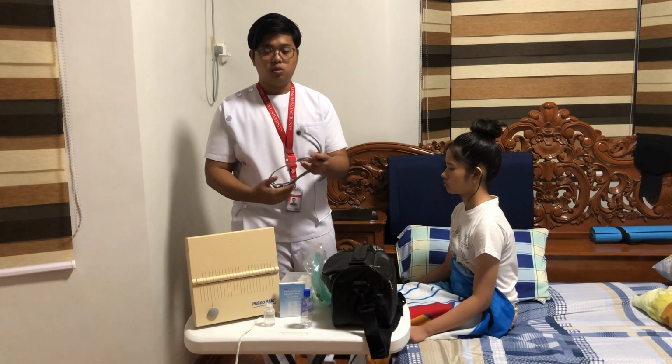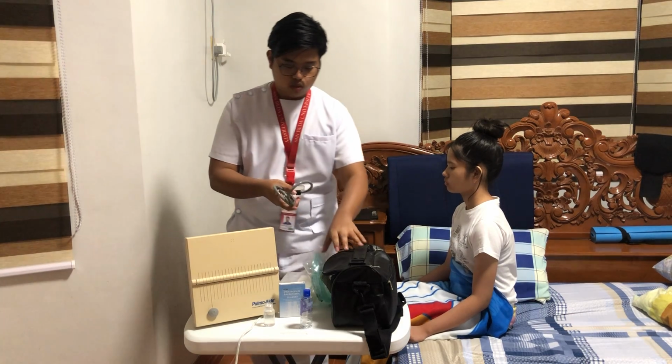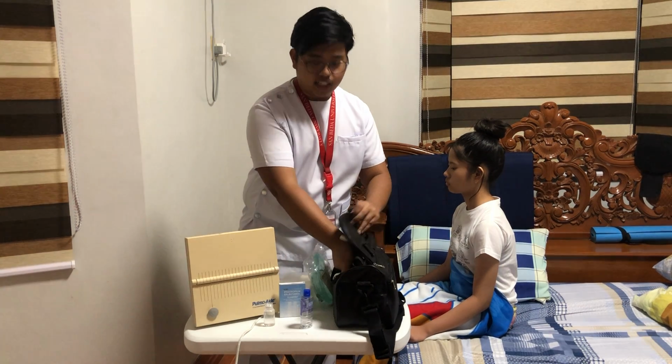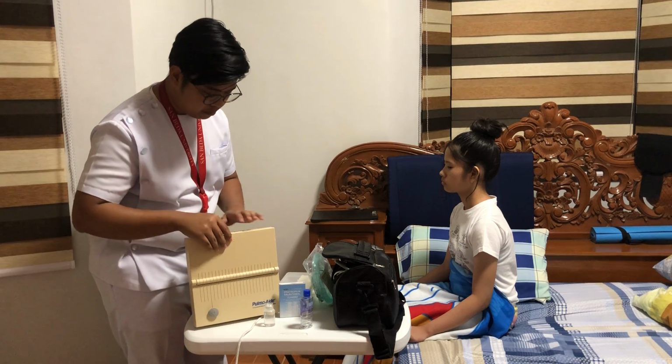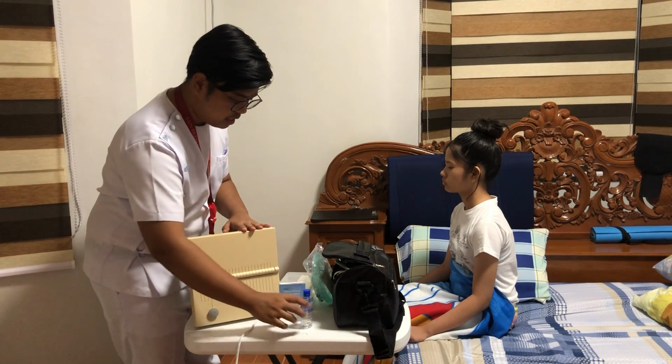Now after doing that, the next thing that we need to do is to attach the nebulizer tubings to the attachment of the compressor, which we have here. We need to set these things aside.